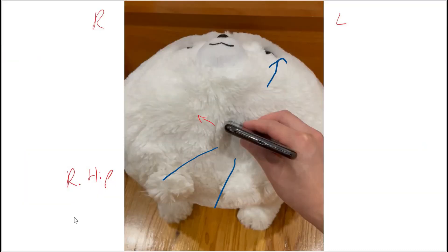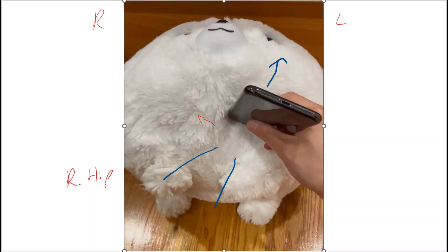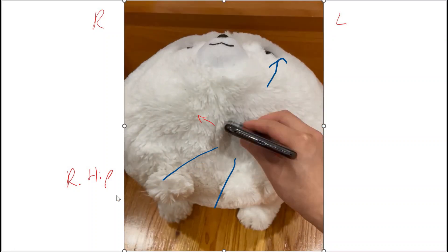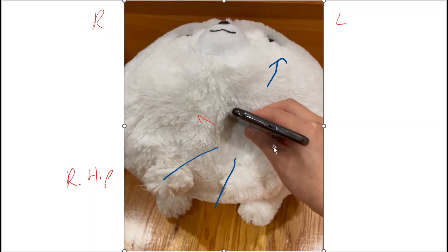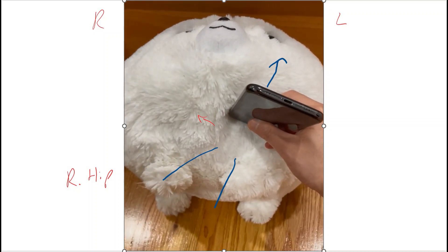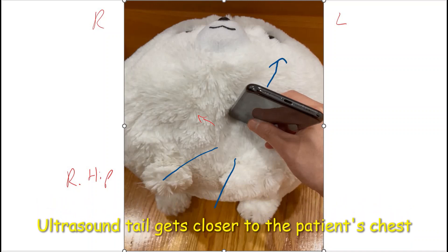To get the RV inflow view, first you get a good parasternal long axis view, and then you tilt the transducer towards the patient's right hip as shown in this video. Here we have the indicator pointing towards the patient's right shoulder, and when you tilt the transducer towards the right hip, your tail tilts upwards and the ultrasound beam goes down like so.